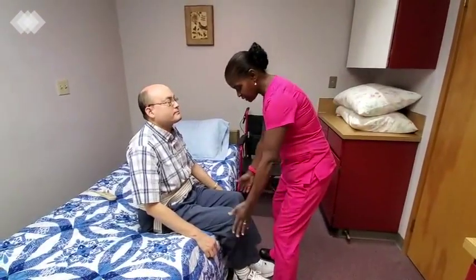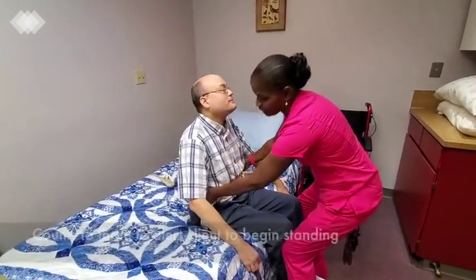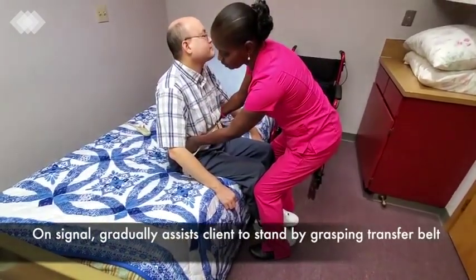I'm going to put my legs on your legs so that you don't fall, knee to knee. And on the count of three, I want you to stand up, okay? With my hands coming in an upward position on the gait belt. On the count of three, stand.